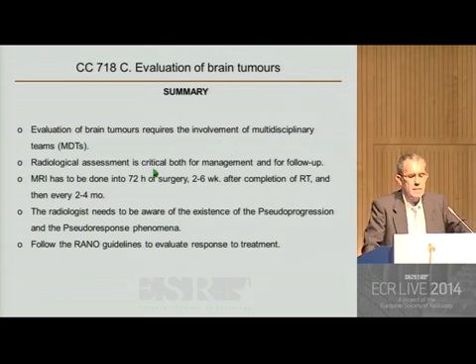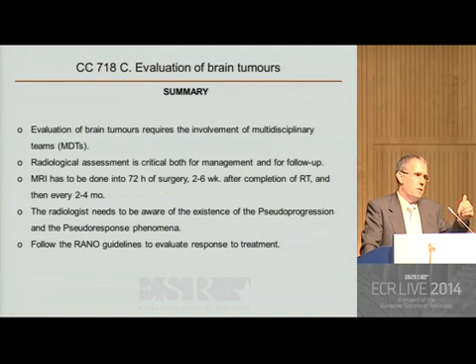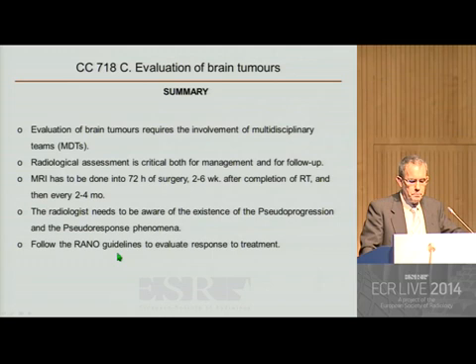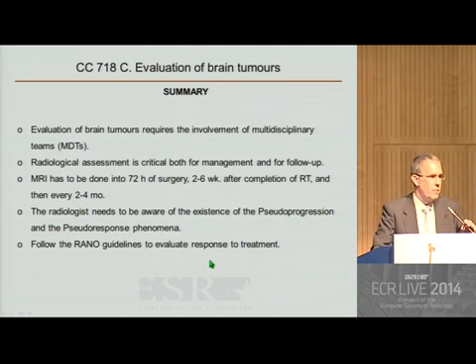The radiological assessment is critical for management and follow-up, and MRI has to be done at 3 times: within 72 hours of surgery, then 2 to 6 weeks after completion of radiotherapy, and then every 2 to 4 months. The radiologist needs to be aware of the existence of pseudo-progression and pseudo-response phenomena. And finally, we should follow the RANO guidelines to evaluate the response to treatment. And thank you very much for your attention.